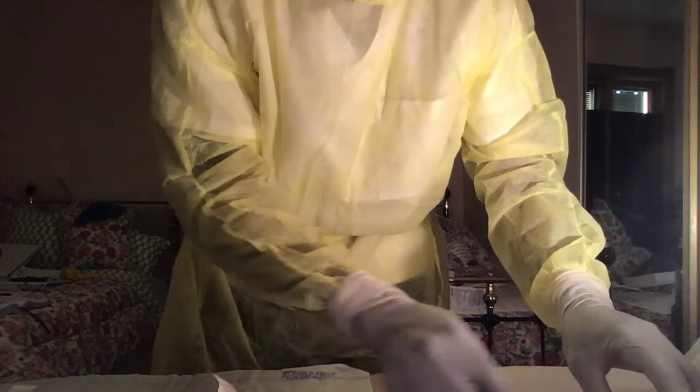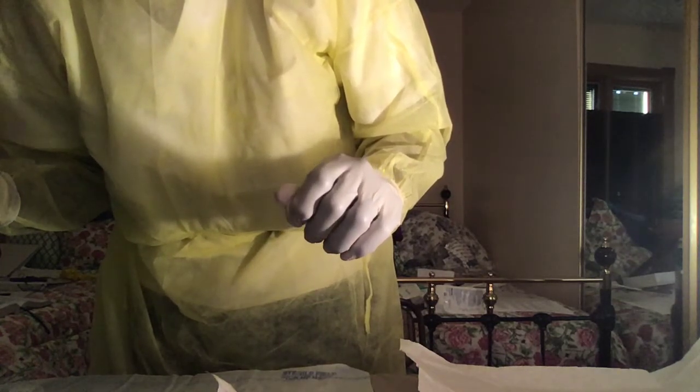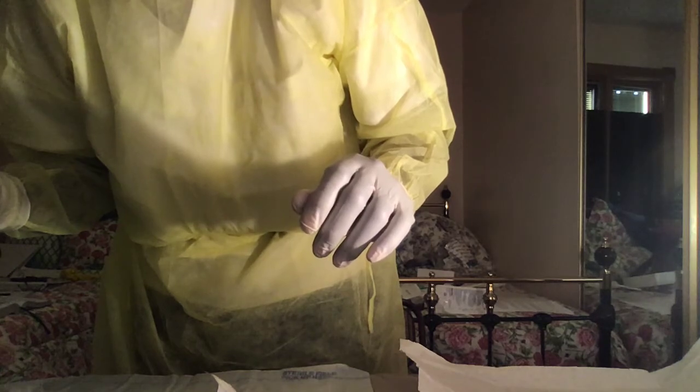I would clean the incision area with sterile swabs. I would clean the incision with sterile swabs. I would paste the pad over it.